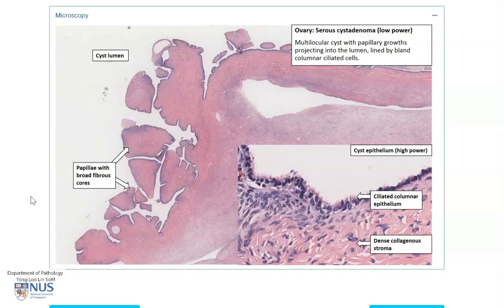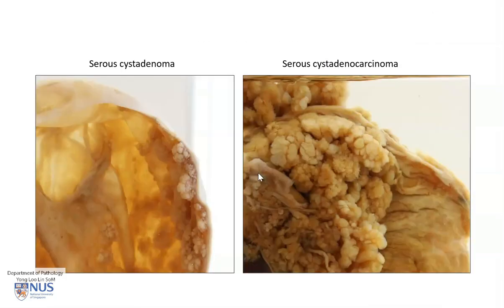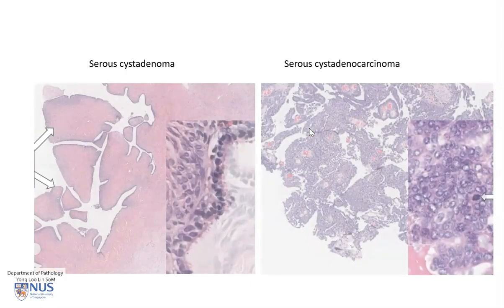We are now going to do a very quick comparison of the gross as well as the microscopic features of benign versus malignant serous tumors. Here is a side-by-side comparison of the gross features of a serous cyst adenoma with relatively small papillary excrescences or projections and no invasion into the cyst wall, as opposed to serous cyst adenocarcinoma, where you can still see a cyst locule but these rather fleshy papillary projections, and you can see them actually outside on the serosal surface or capsular surface of the ovary.